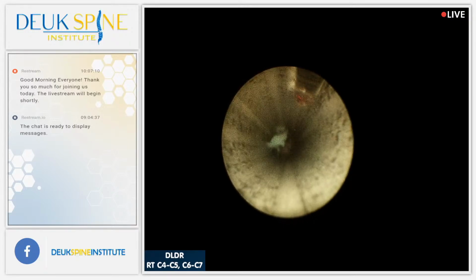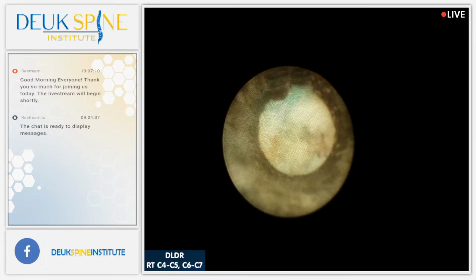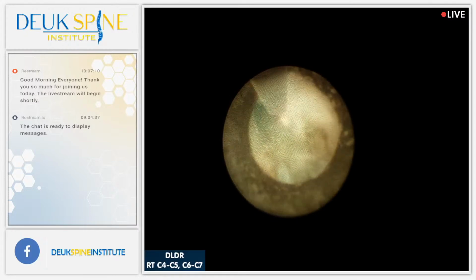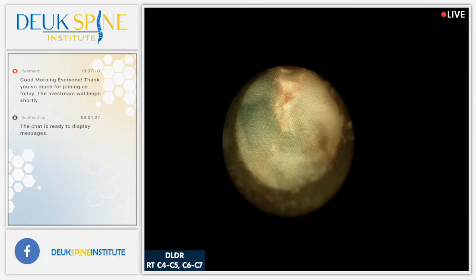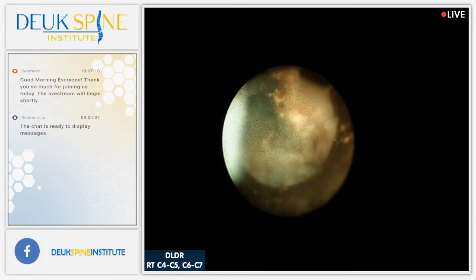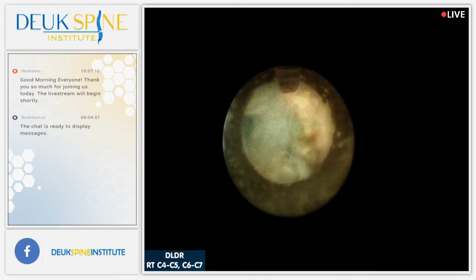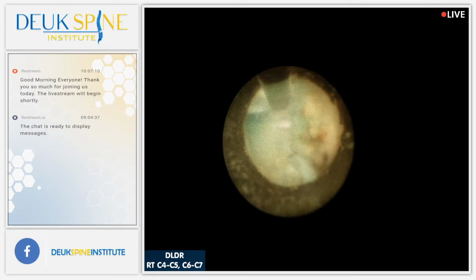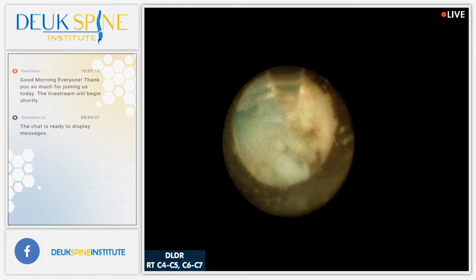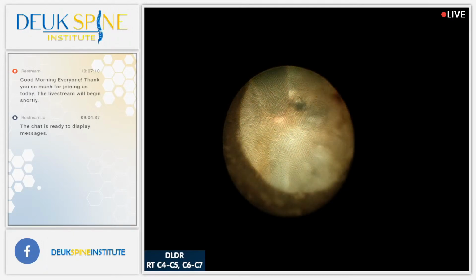And that increases blood circulation and blood flow to the area, but it only increases it to the muscles. It's not actually going to fix your disc herniation. The problem is that most people with back pain, 82%, 83%, have a herniated disc as the cause. And lasers applied to the skin will never fix that. They will never get rid of the symptoms either. The only way to get rid of the symptoms is going to be to do an annular debridement endoscopically, like you're seeing right now. There is no other way that works.